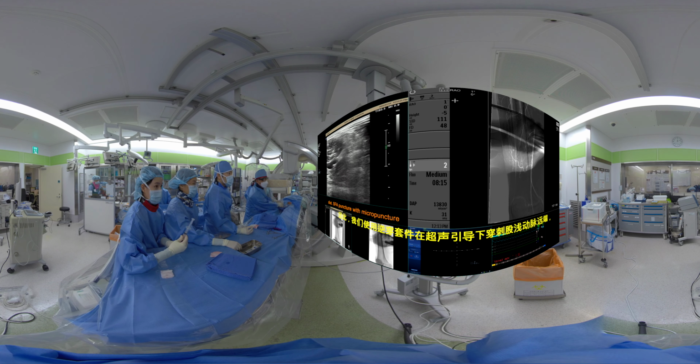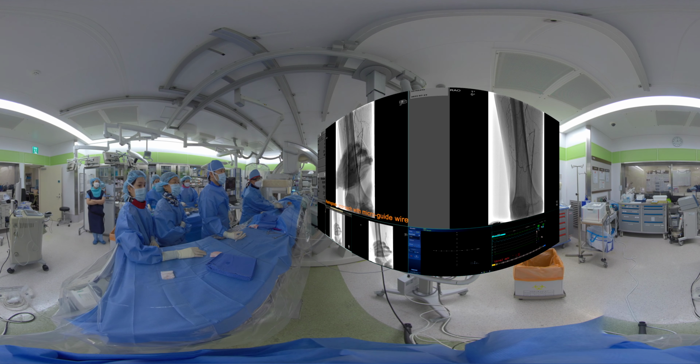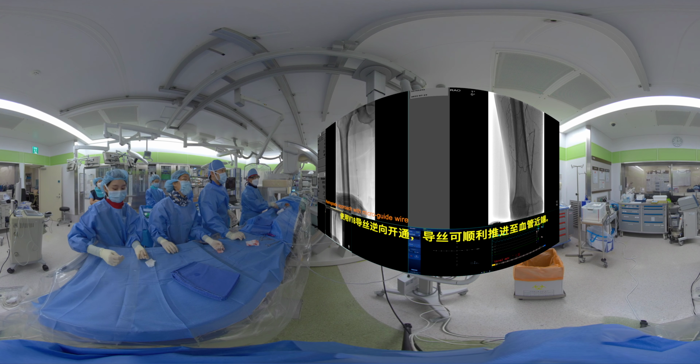So ultrasound-guided distal SFA puncture was performed with a microneedle. The V18 wire was able to be advanced proximally without problems.